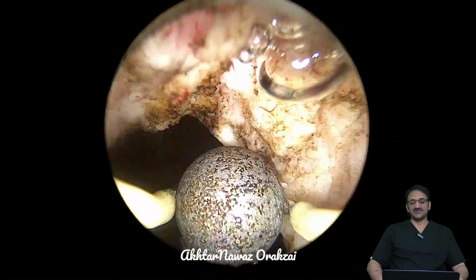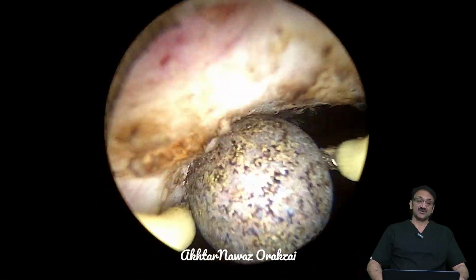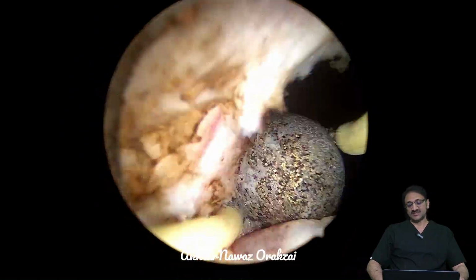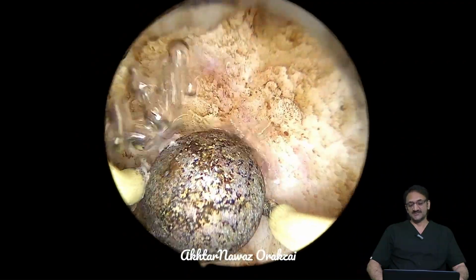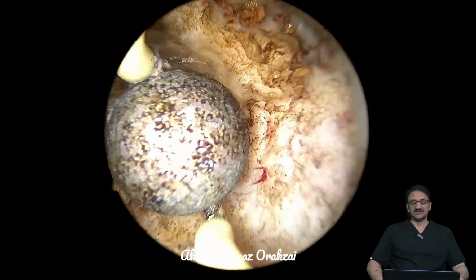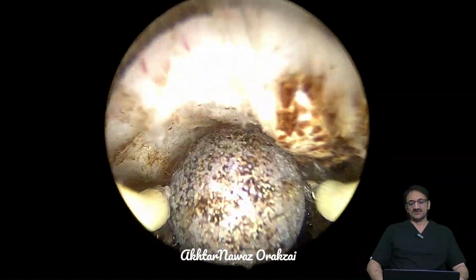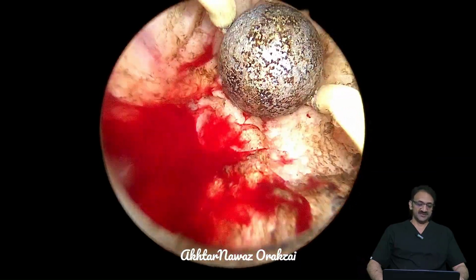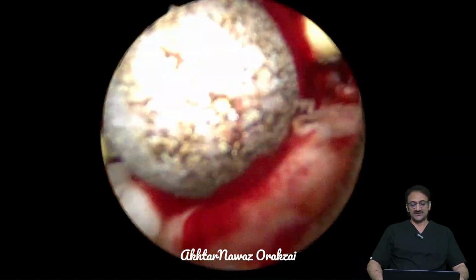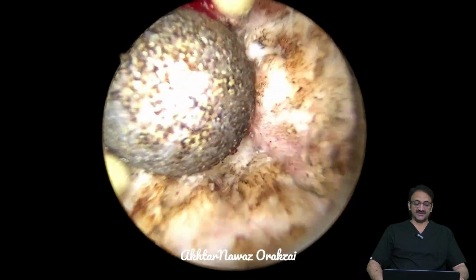I do not use the diathermy spurts more than 1 or 2 seconds. You can use it up to 3 seconds, but prolonged use of diathermy can lead to charring, and that charring can lead to infection, and also to irritative lower urinary tract symptoms after the catheter removal. So I do the minimum coagulation of the prostatic cavity.